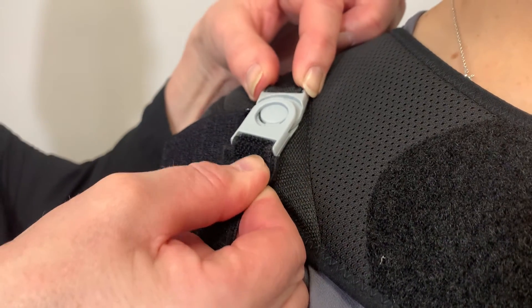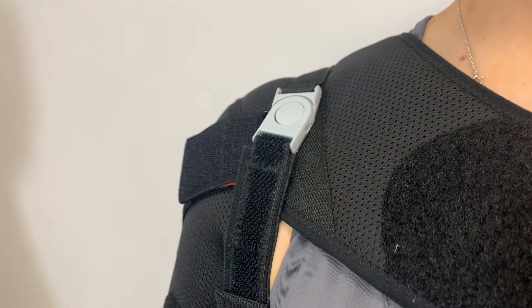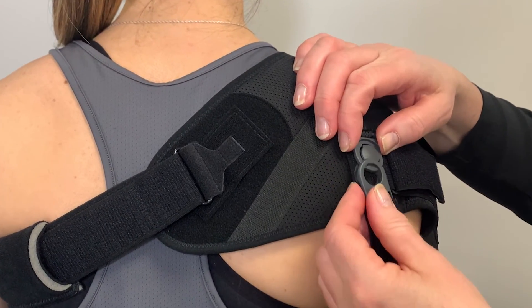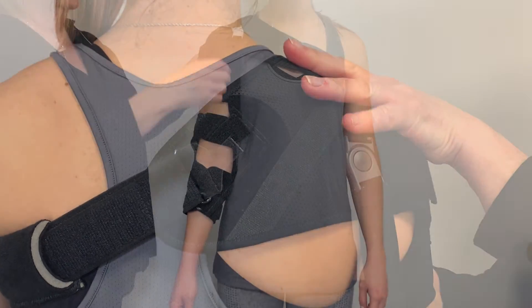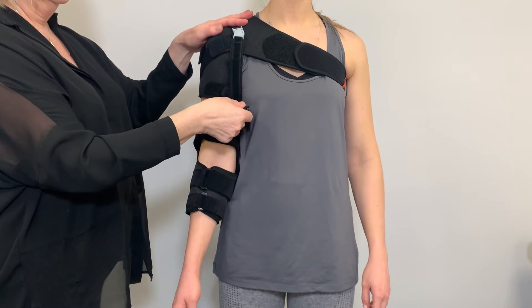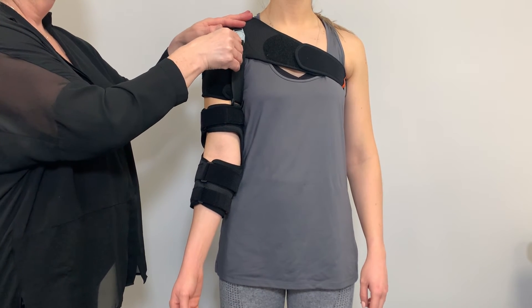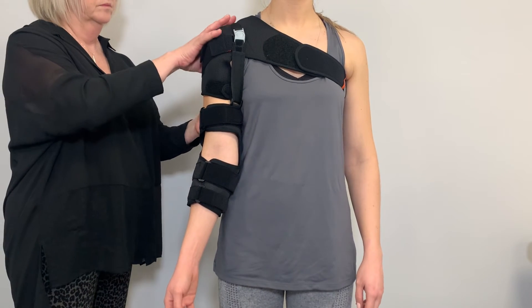Finally, the lifting straps are connected to the shoulder elements of the same colour. This dynamic strap must be placed under slight tension. To do this, adjust both straps equally to the required length.